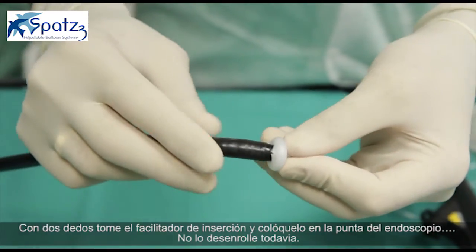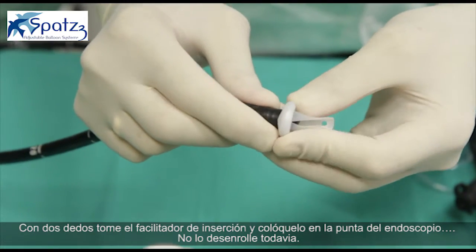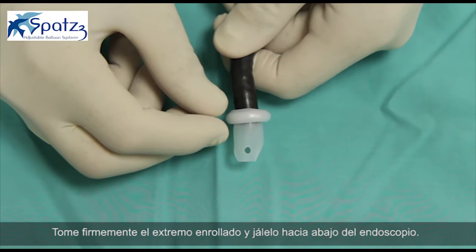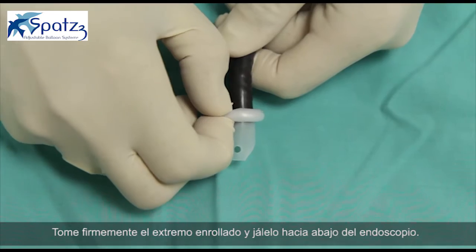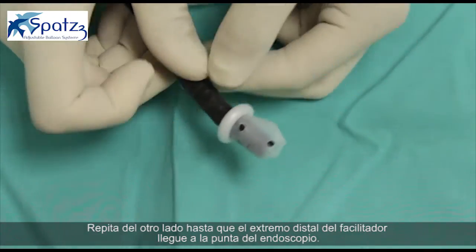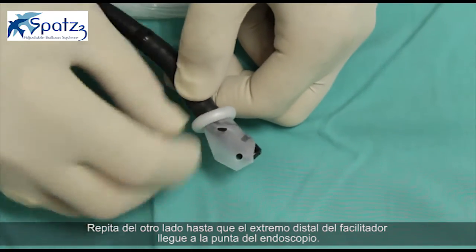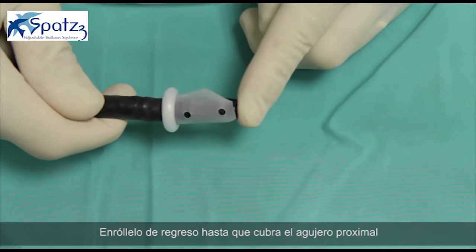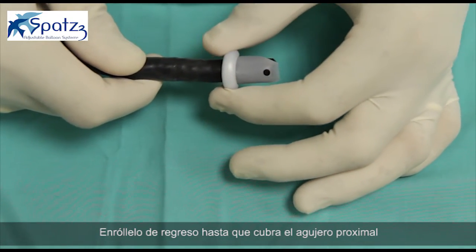With 2 fingers, hold the insertion facilitator and place it on the end of the scope. Do not roll it on. Firmly grab the rolled edge, lift away from the scope, and pull it down the scope. Repeat on the other side until the distal edge of the insertion facilitator reaches the scope tip. Roll it back until it covers the proximal hole.